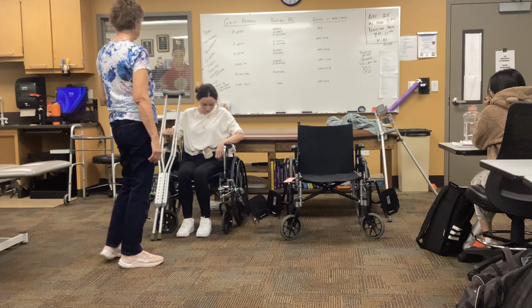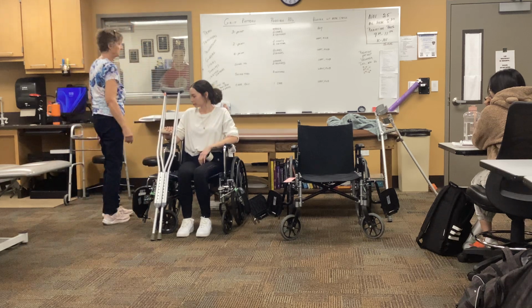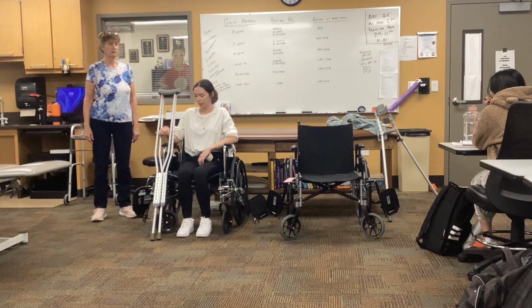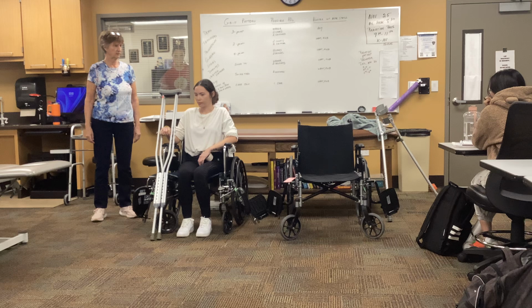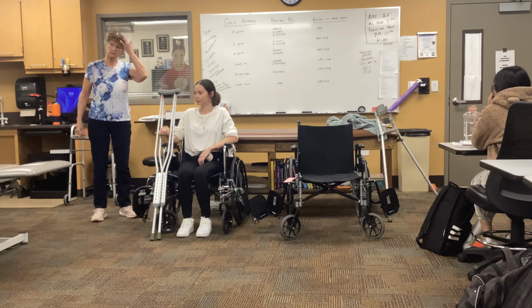Again, needing to teach the patient that they have to keep these somewhere close, so when they go home, they have access to their crutches easily. Okay? All right.